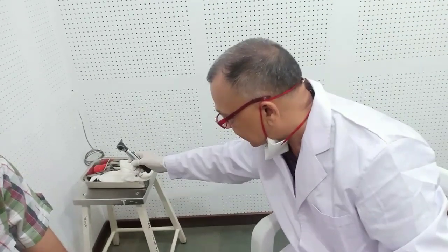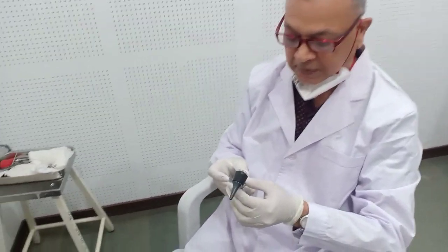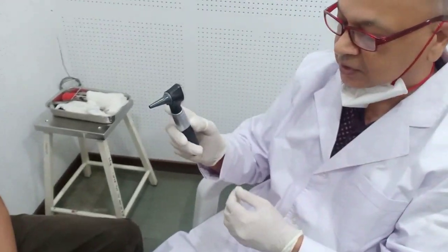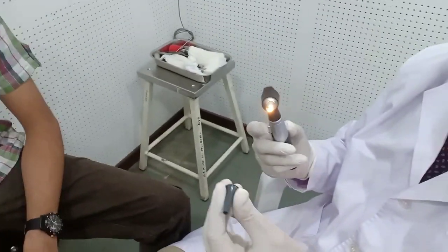In the otoscopy examination, we will be examining the external auditory canal and tympanic membrane. And if the tympanic membrane is very thin, or if a big perforation is there, we can see some part of the middle ear. So otoscopy examination provides us good illumination and magnification also. So this is the otoscope, and you can see this ear speculum.